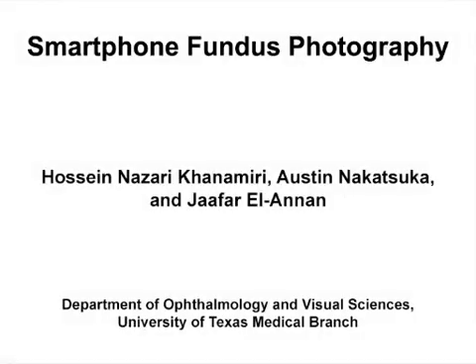The overall goal of this method is to acquire retinal images using a smartphone camera. This method facilitates the recording of ocular fundus images using a smartphone camera and a conventional handheld high-plus power ophthalmoscopy lens. Really, the main advantage of this technique is the widespread nature of smartphones, allowing us to capture optic nerve and macula pathology outside of the clinic.